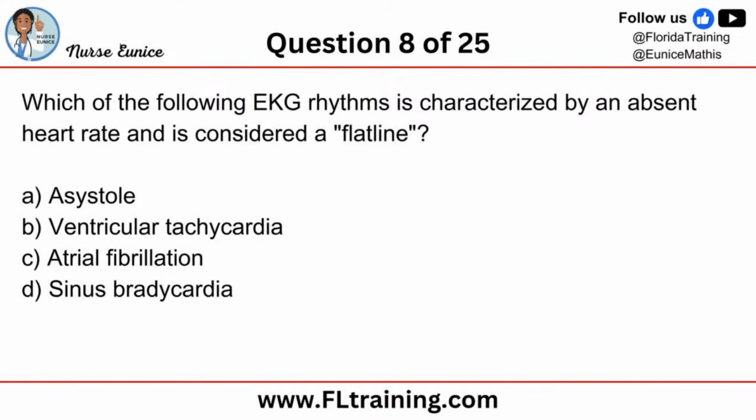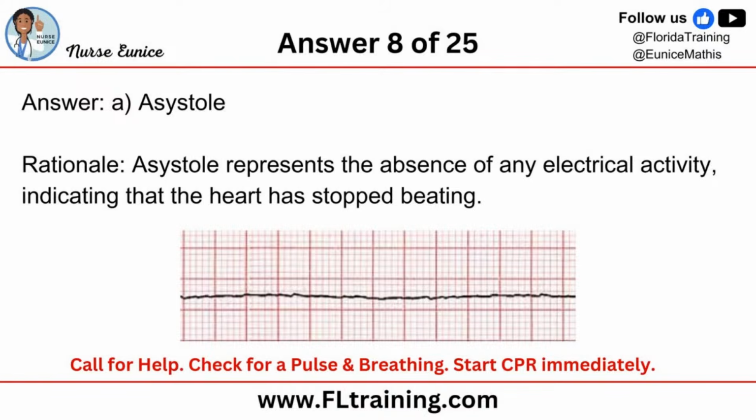Which one is considered a flat line? Buck, you are rocking it today. Yes, Buck and Imani. Yes. So I'm going to go ahead and reveal the answer.